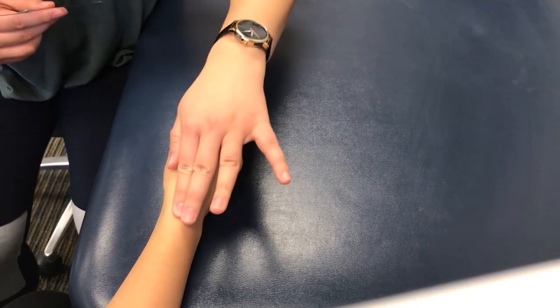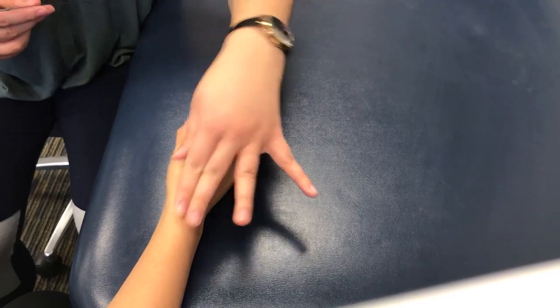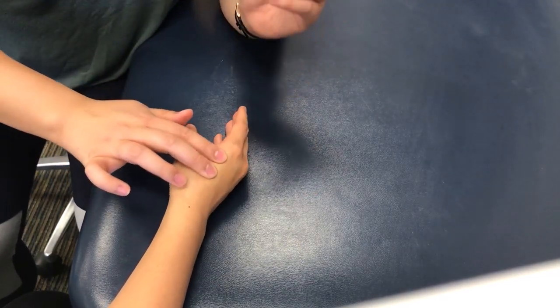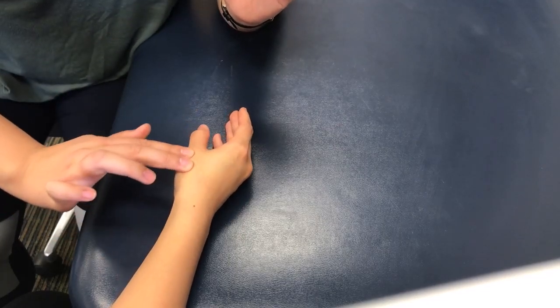For thumb CMC abduction, the patient will be seated in a chair with their arm resting on the table like so. The forearm and the wrist are both in neutral, so their thumb is up. The axis will be on the lateral aspect of the radial styloid. And then the proximal arm will be along the second metacarpal, and the distal arm will be along the first metacarpal.